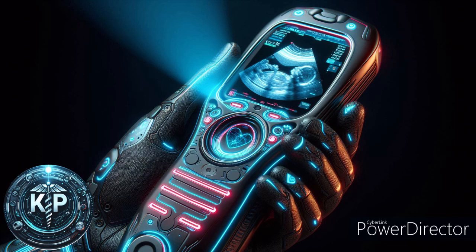Scan converter. The scan converter translates the ultrasound data from the beam spatial format into the format of the display screen. It also stores the image data in memory, which can be manipulated to change the image before it appears on the display. Acoustic lens. This component focuses the emitted sound waves from the transducer probe. It ensures that the waves are directed to the precise area of interest within the patient's body.